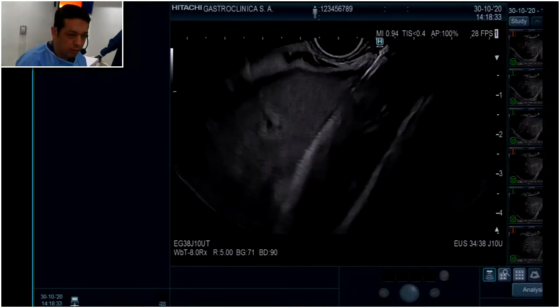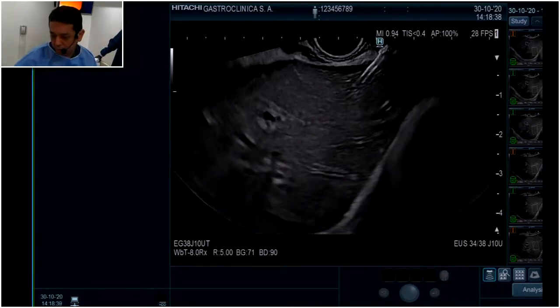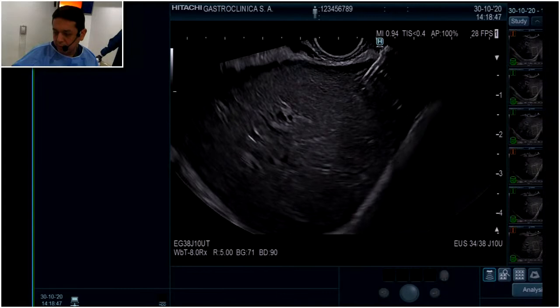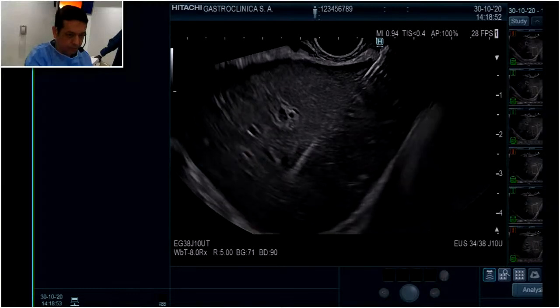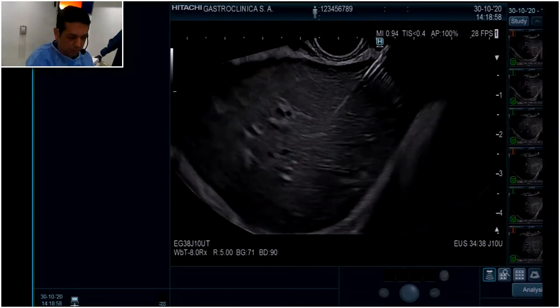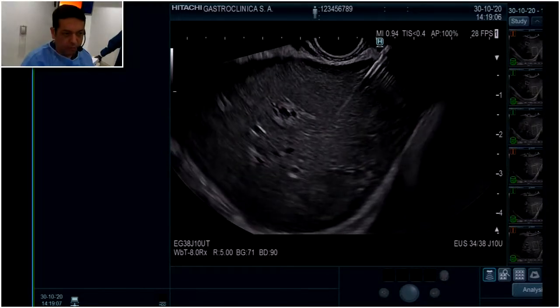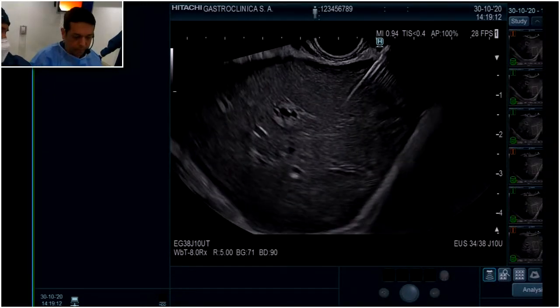Let's go to see the quality of this needle. This is very important. I will do a small aspiration. Pequeña, menos. 5. Just a small aspiration, huh? I like the aspiration. Opa. Okay. Ok, ahora hay que sacar esto. No necesitamos sacar esto, necesitamos sacar esto, no.